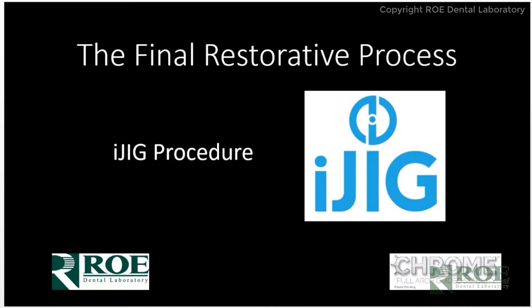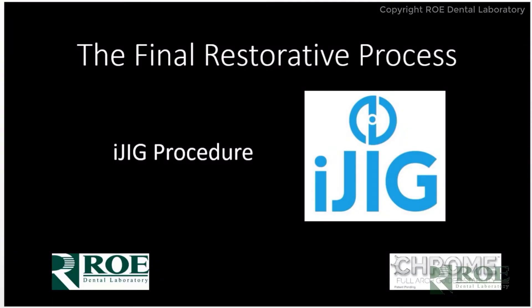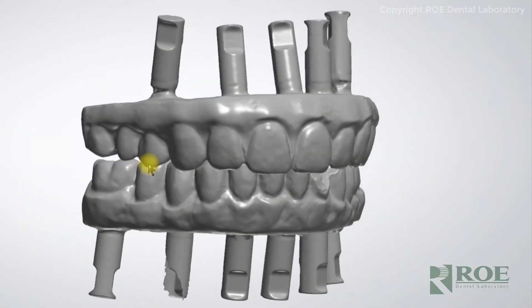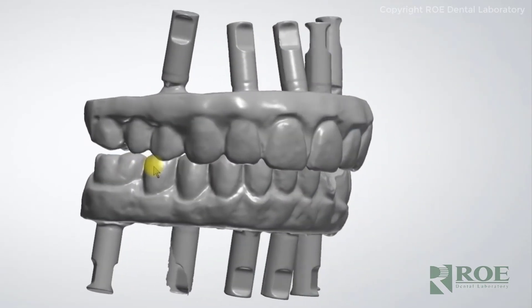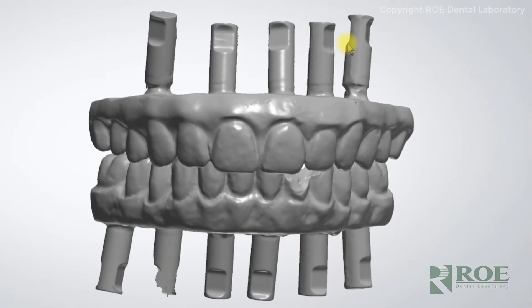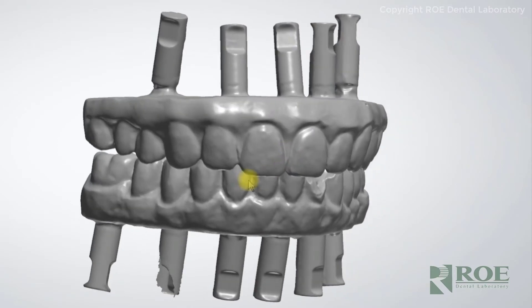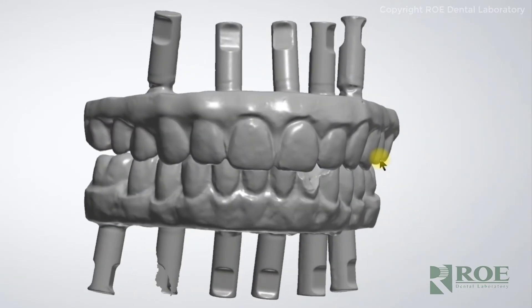The restorative phase uses the iJIG protocol, which Dr. Quittmeyer opted for. The doctor removes the long-term prosthetic from the mouth and adds the iJIG scan analogs to the prosthetic. The iJIG is a proprietary system for Roe Dental Laboratory and Chrome Guided Smile. The doctor removes both prosthetics from the mouth, screws down the iJIG scan analogs to each site — upper and lower — scans the upper, then removes the iJIG scan analogs and screws them in the mandibular arch, digitizing both arches completely, 360 degrees of the arch with the scan bodies. Then the prosthetics go back into the mouth and are screwed down, and that is when the bite is captured.